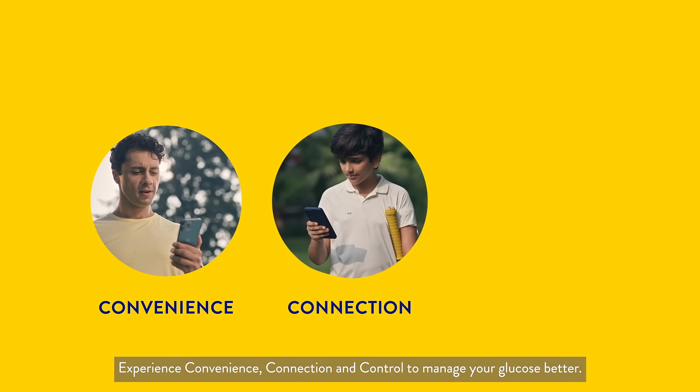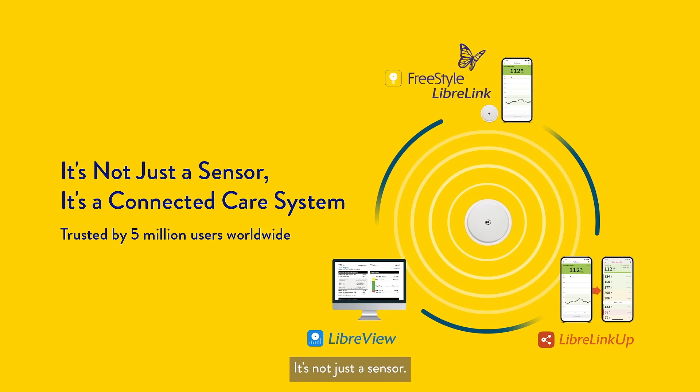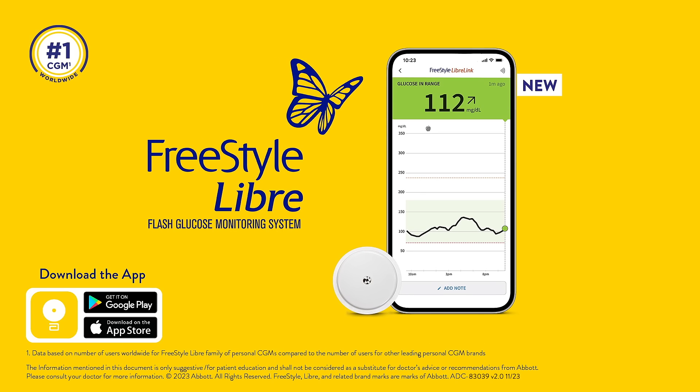Experience convenience, connection, and control to manage your glucose better. Freestyle Libre — it's not just a sensor, it's a connected care system. Download the Freestyle Libre Link App today.